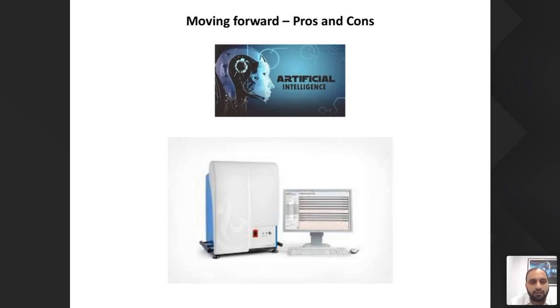into it. Here I would like to confess that I have not entirely shifted to CellaVision as yet, but almost 80% of my slides are going into CellaVision. Some few I still see under the microscope. Sometimes, because accepting change might be difficult, with CellaVision I still doubt it. I go and look into the microscope. However, I have never found any change, but still I tend to do that.